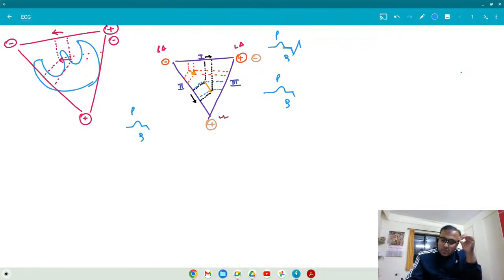What about lead 2? What can you comment on in the same way? Okay, so positive, positive, more. So lead 2. And what about lead 3? Okay. So like this. Correct? Clear? All of you?